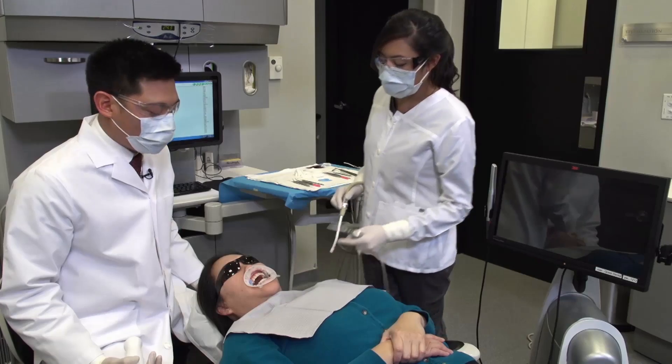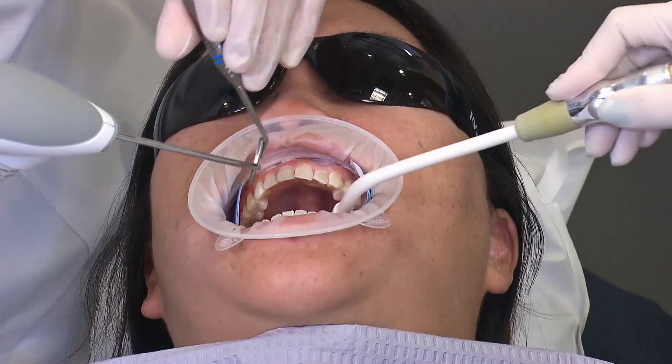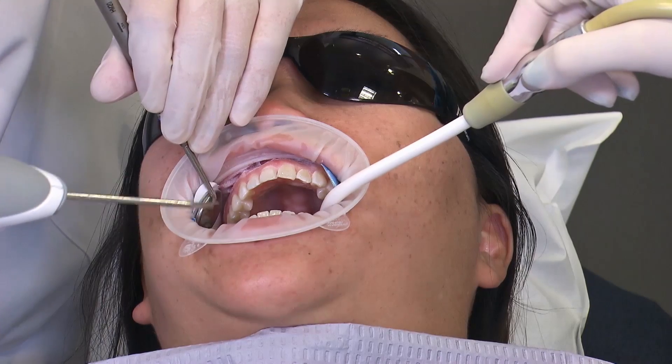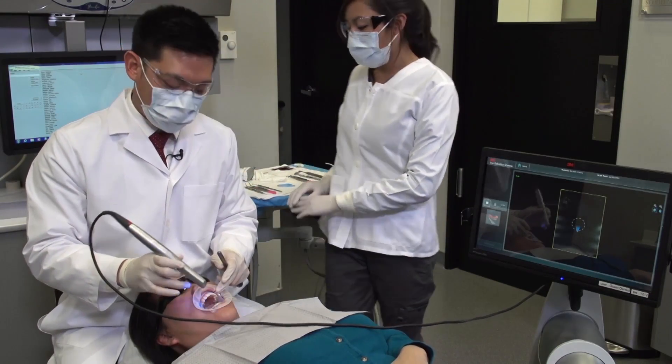Once the teeth surfaces are dry, the 3M scanner requires a light dusting of a contrast powder, which is titanium dioxide. That just helps the system capture the data a lot more efficiently. Once the light application of the contrast spray is applied to the teeth, we can begin scanning.